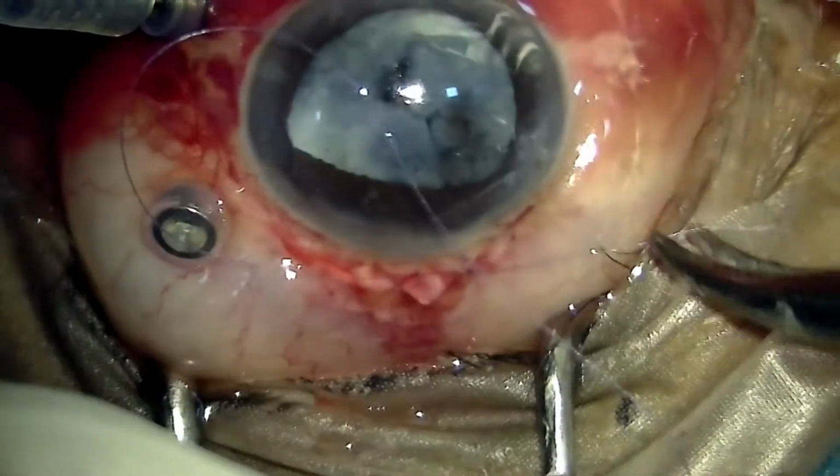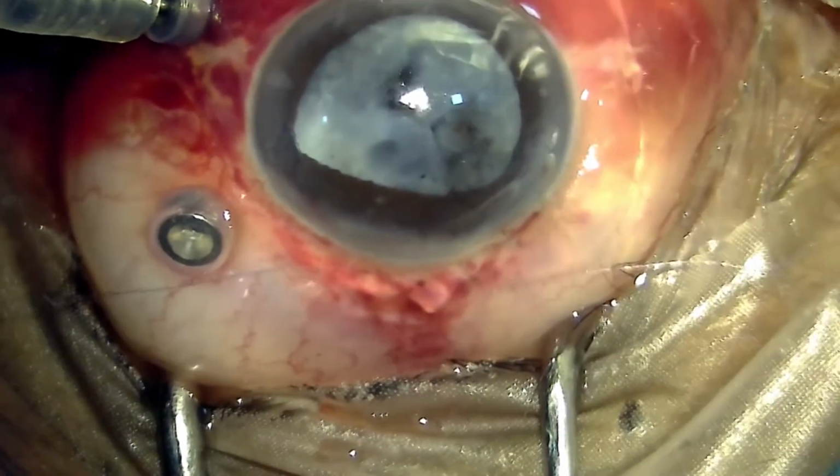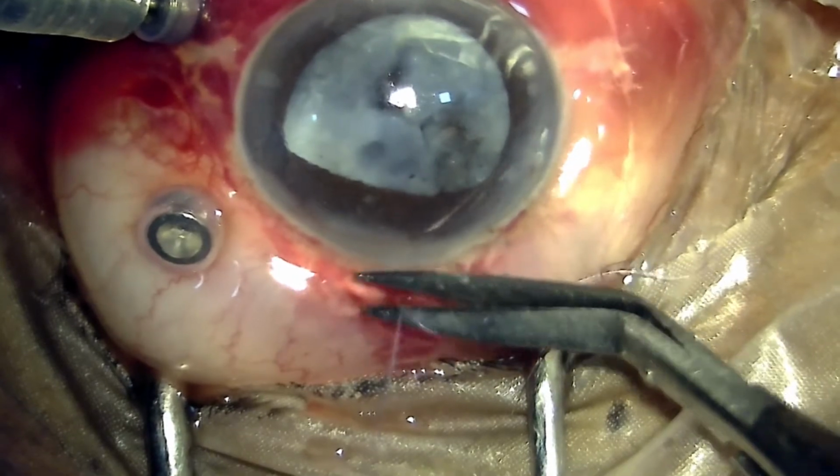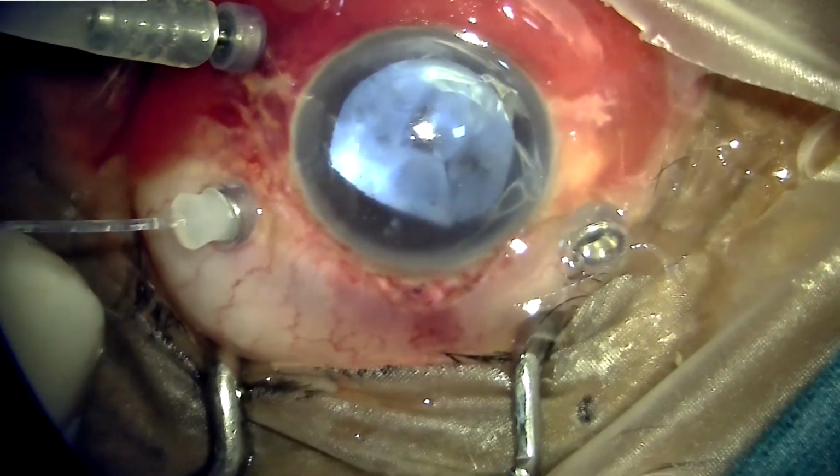the center, and as a result this gentleman, when being operated for phacoemulsification, developed a posterior capsular tear and the surgery was converted into a small incision cataract surgery, but the surgeon was unable to manage because of the vitreous prolapse, so it was referred to us.